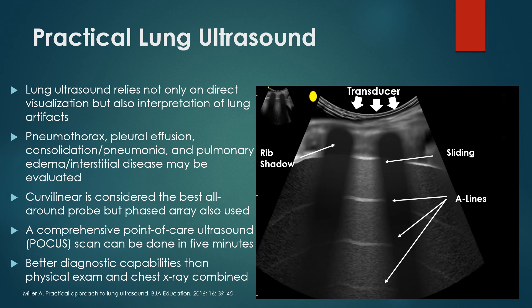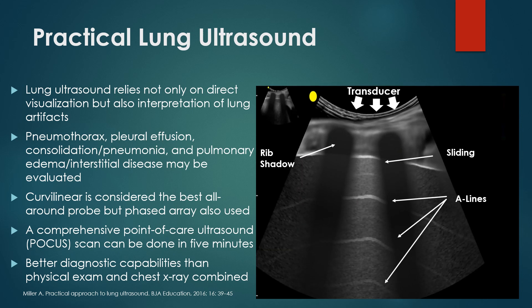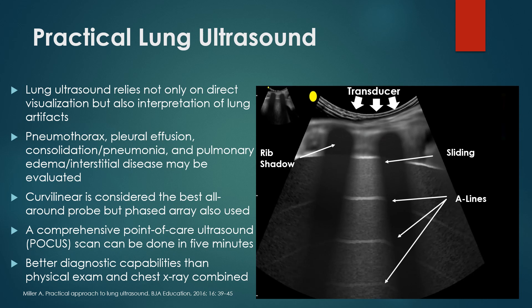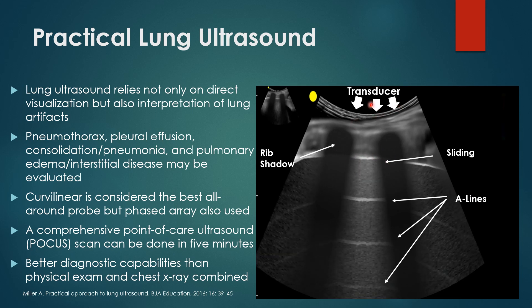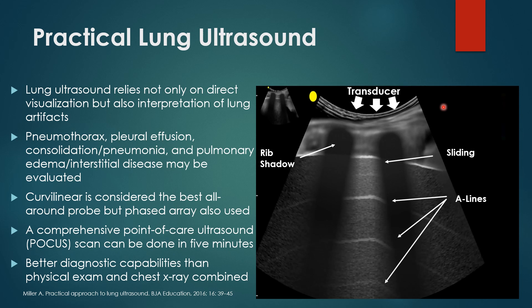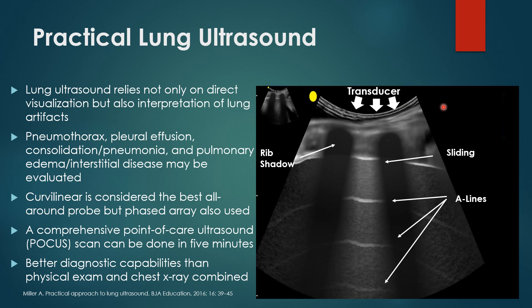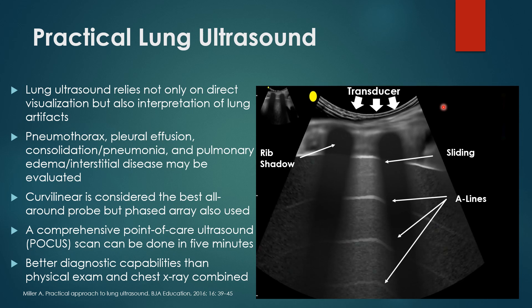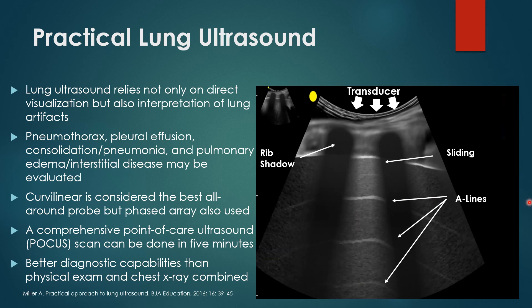Lung ultrasound relies not only on direct visualization but also on the interpretation of lung artifacts. Air does not reflect very well, but you get interesting artifacts that tell you a lot about what's going on. Typically, normal findings include A-lines and sliding along the visceral and parietal pleura. Physical findings include pleural effusion as a very anechoic region in the chest, consolidation as the alveoli become filled with fluid or blood giving it an organ-type appearance, and pulmonary edema and interstitial disease evaluated through B-lines.